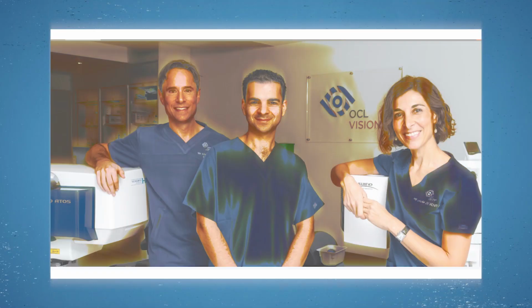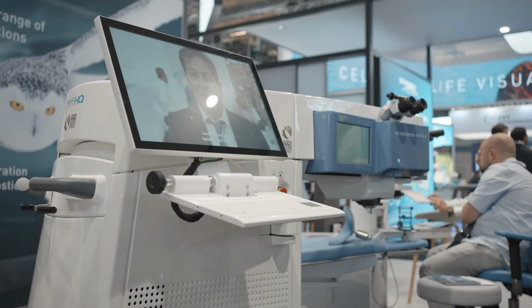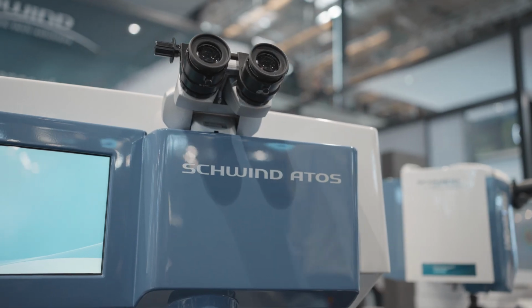I'm Allon Barsam. I'm a director and partner at OCL Vision in London, and I specialise in refractive cataract surgery and corneal surgery. The Schwind ATOS is Schwind's femtosecond laser, which is used for LASIK and SmartSight laser-assisted lenticule extraction.